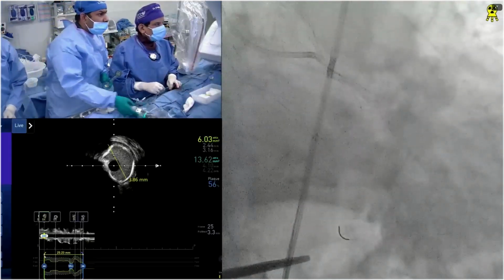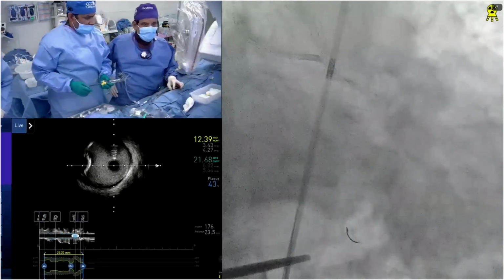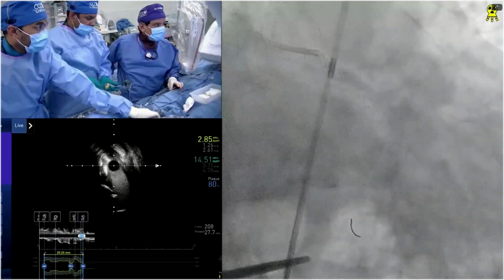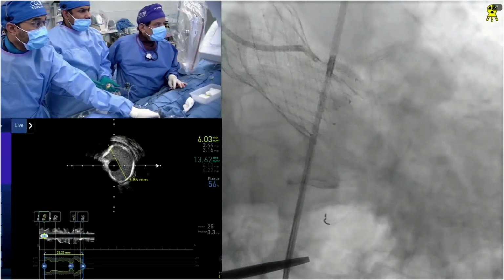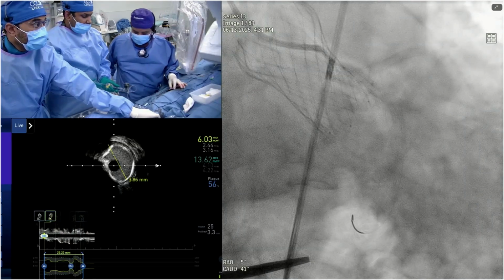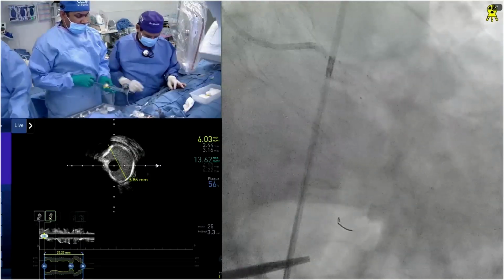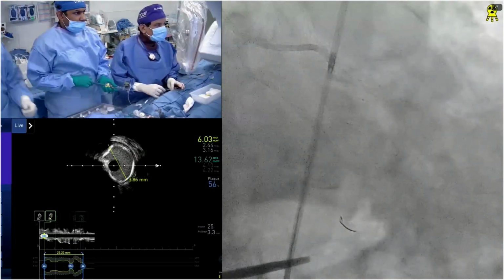Yeah. Circ is the tight lesion, and here this is a 3.5 IVL. Go. Right. 4. My other observation is that we are going to be encountering a lot more of these cases. Oh, quite a bit. Yes.